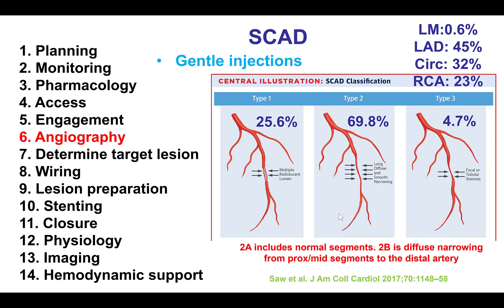Coronary angiography is critical for the diagnosis of spontaneous coronary artery dissection. The classic appearance of multiple radiolucent lumens, which is SCAD type 1, is actually present in the minority of cases, about 25%. The most common presentation is that of a long, diffuse, smooth narrowing — this is the type 2 SCAD — that can be subdivided into type 2A, which has some normal segments, and type 2B, which is diffuse narrowing that goes all the way to the distal segment of the coronary artery.